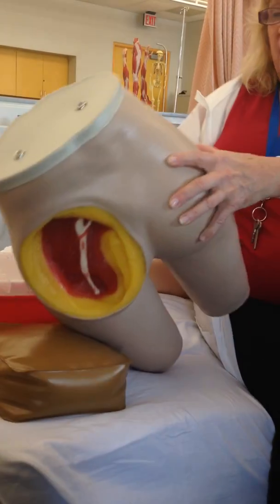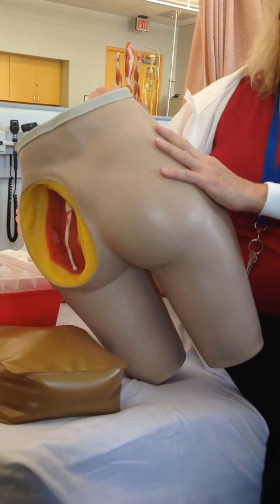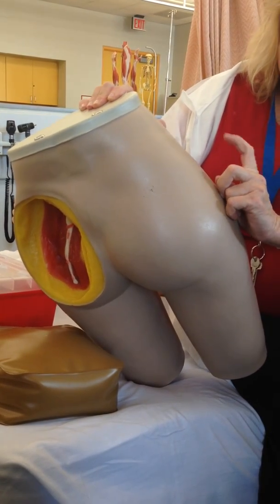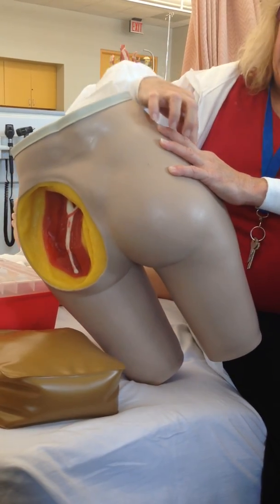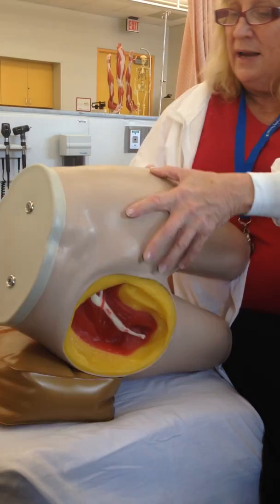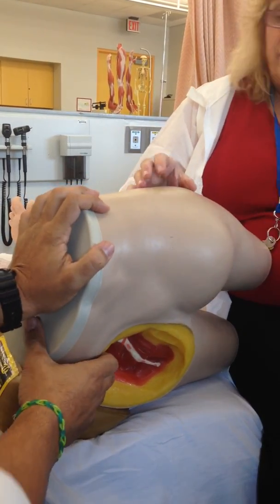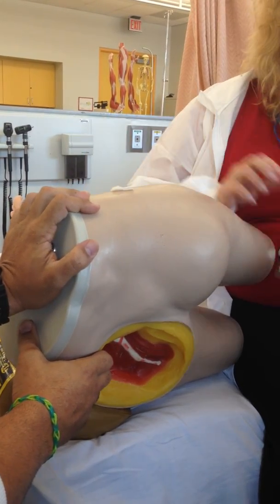And you're going to put the palm of your hand on the head of the femur. And then right here, the anterior iliac crest, your pointer finger or index finger is going to go there. You're going to spread this, and it's 1 inch above that. So we're going to find that site. Ariel, hold your hand here while I give this injection here. You're going to find the site. Okay, you're going to mark it with that.